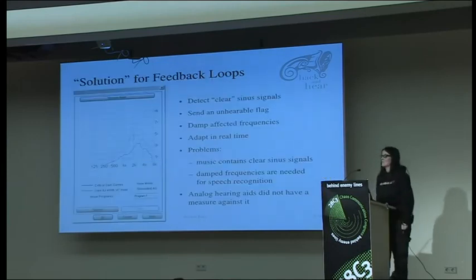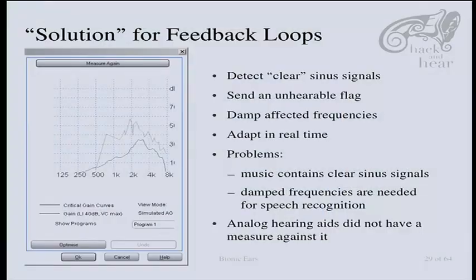And what the hearing aids do is try to detect feedback loops. So they look for clear sine signals, and when they detect one, they send an unhearable flag saying I detected one, and then the affected frequencies get damped until it doesn't squeak anymore. They can adapt in real time, so it works really fast, but it's still hearable.